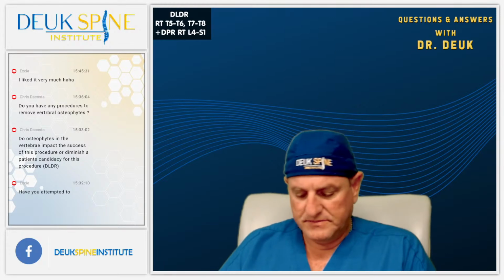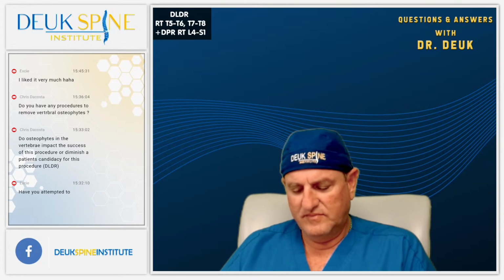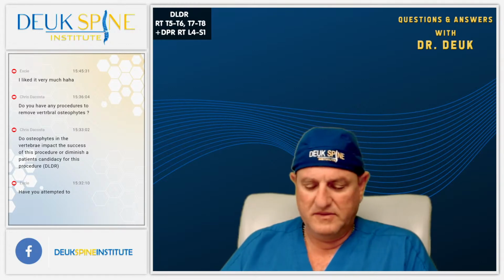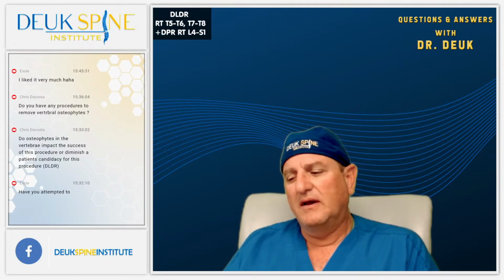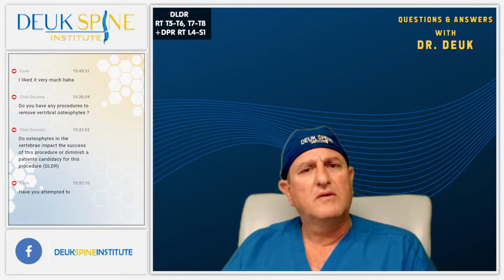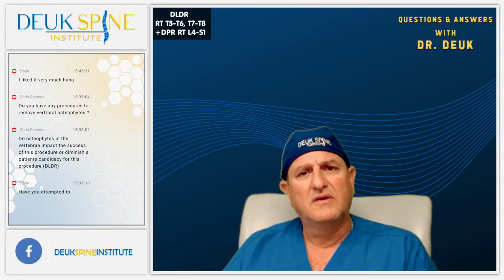And then last question from Chris asking, do you have any procedures to remove vertebral osteophytes? Do I have any recommendations for procedure? No, do you have any procedures to remove vertebral osteophytes? Yeah. So Chris, once again, the laser that you just saw removes osteophytes. The reason why we don't remove more osteophytes is it's not necessary to remove osteophytes.